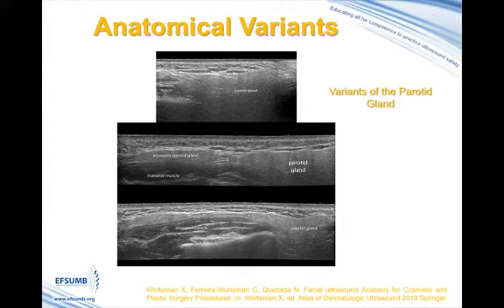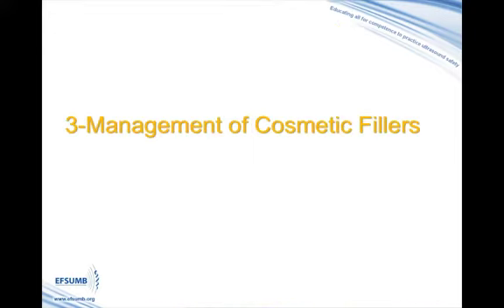Usually, the variants of the parotid gland follow the axis of the location of the parotid duct. These variants are relevant because they can be damaged during the aesthetic procedures. The third indication is the management of cosmetic fillers.